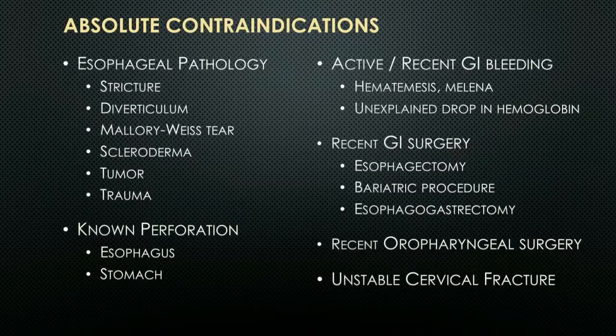Other test-worthy questions: absolute contraindications for TEE. Again, there may be some hedge room on this. There's some equivocation in some documents. They're not going to go after minutia. They're going to go after big things. So just to be aware, you should think of these.